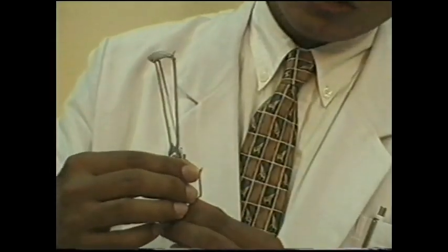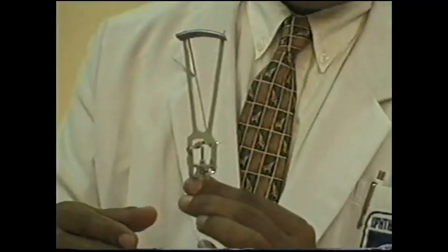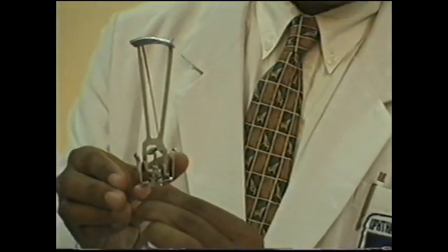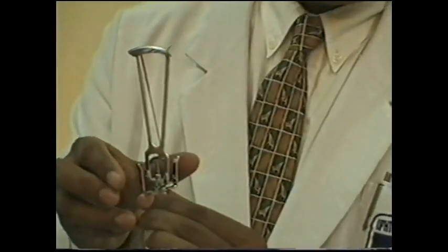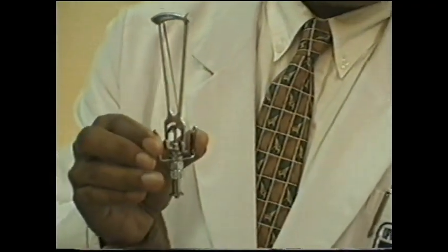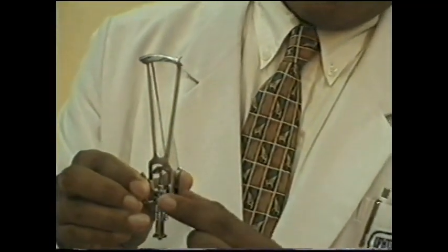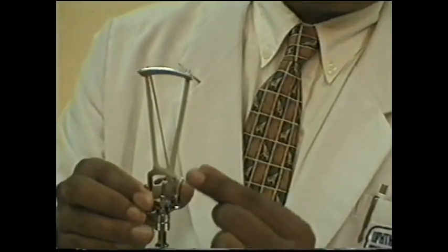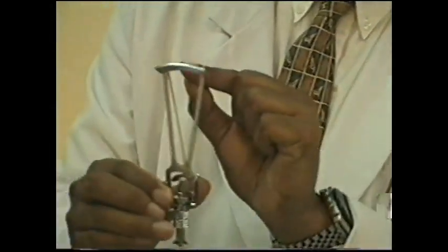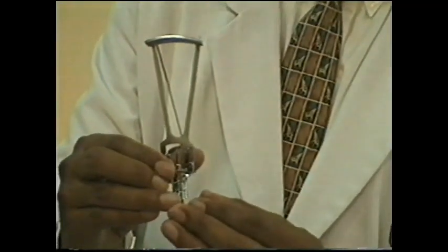In performing Schiotz tonometry, the examiner should make sure that the dominant hand has a good hold on both handles, wherein the thumb and the four fingers are positioned in such a way. When performing the examination, you must not forget that the scale must be facing the examiner during the examination.